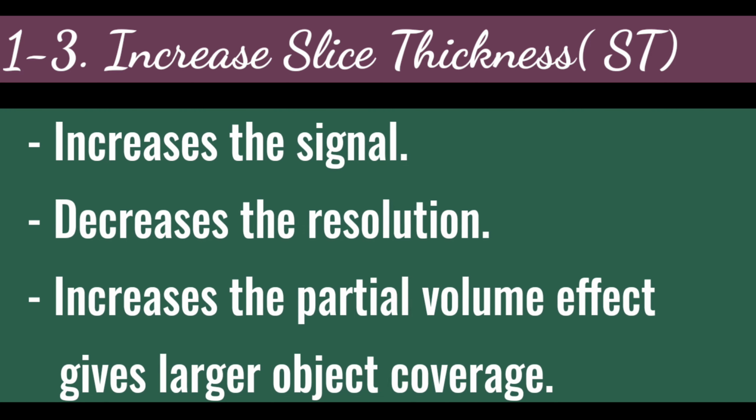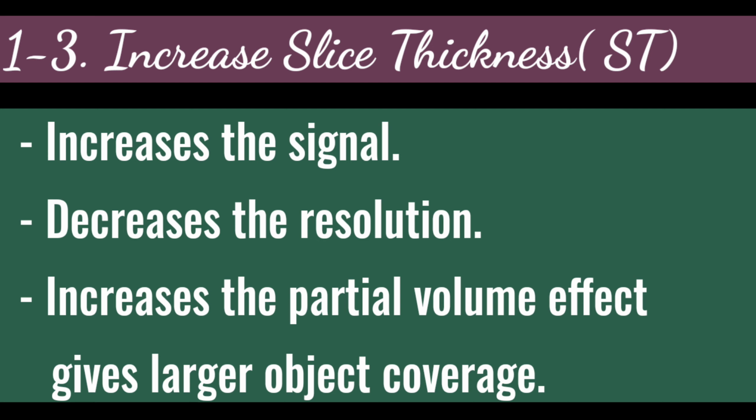Lower resolution. The voxels become larger, with an increased viewing area. Slice thickness. Increasing the slice thickness increases the signal, decreases the resolution, increases the partial volume effect, and gives larger object coverage.